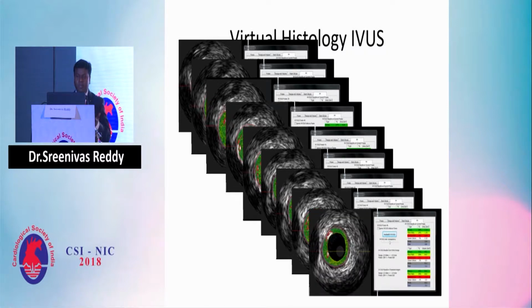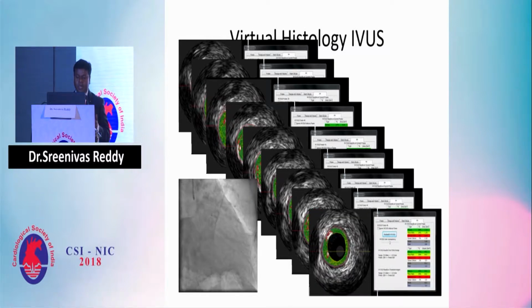This is a stable coronary syndrome patient. You have less necrotic core. So this patient undergoes a PCI, and that's the result.